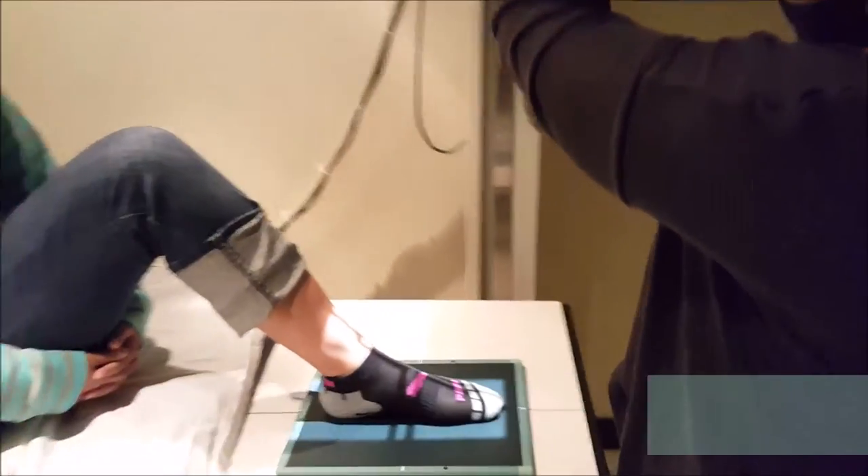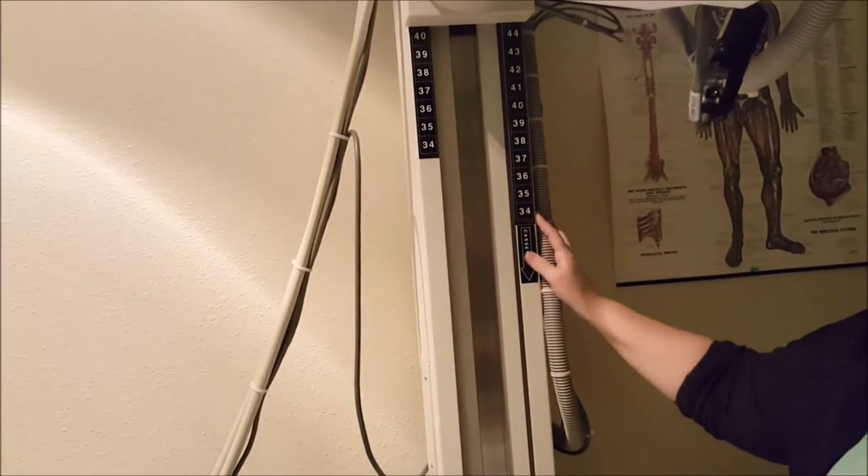You're going to have the patient sitting on the table here. You're going to have a 40-inch SID — that's going to be tabletop, so at 40 inches.